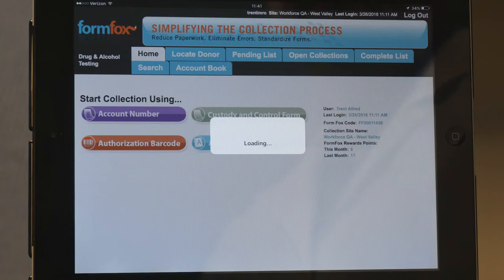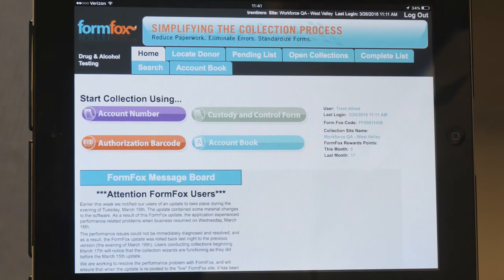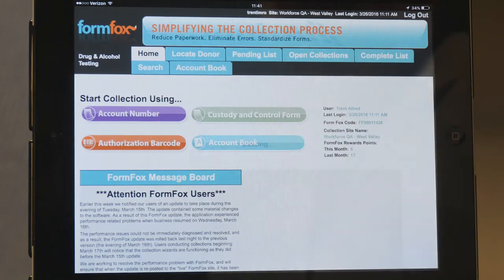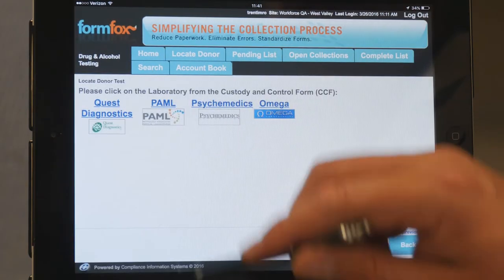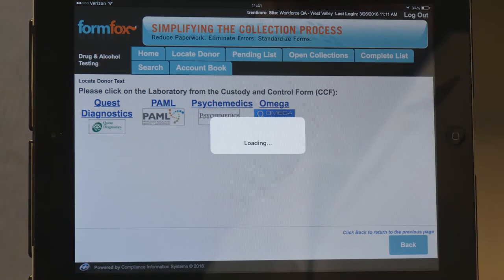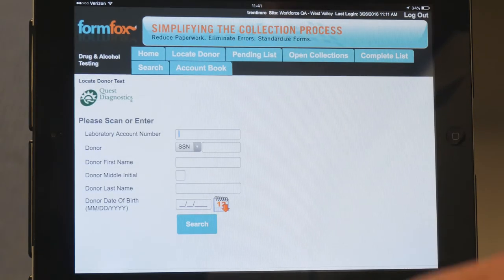For this example, we will assume that the donor does not have a pre-order. You will tap on the purple-colored link and start collection using account number. After tapping the account number link, you will see a menu of laboratories. Account-specific information can vary from lab to lab, therefore you must select the lab which will be processing the specimen in order to generate the right CCF. For our first example, we will choose Quest Diagnostics.